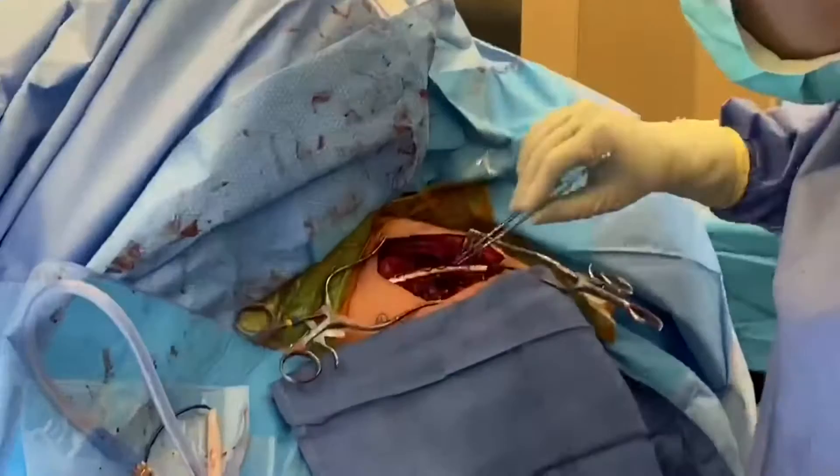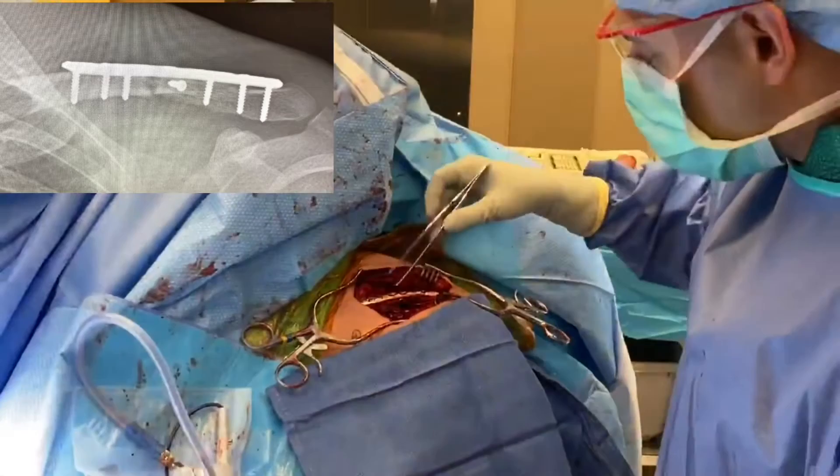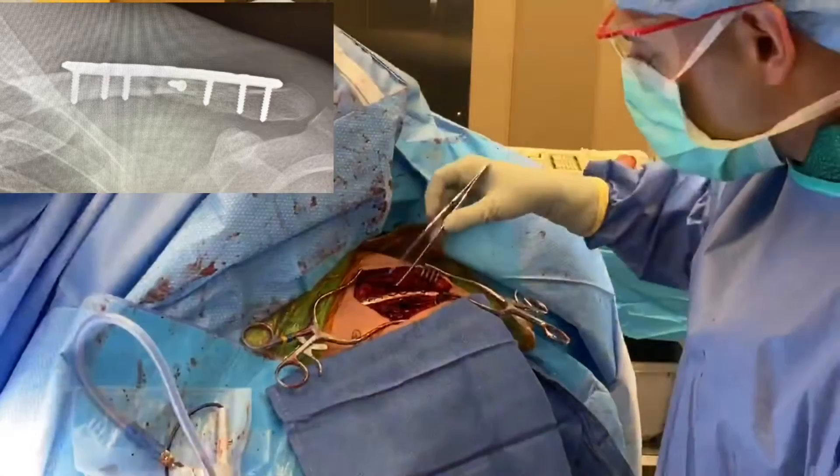Okay guys, so we have fixed everything here. We had that lag screw — you can see that going from front to back here. That stabilized the lateral fragment and then we were able to get that piece next to the other piece. We've got a stainless steel plate on top, three screws on the medial side and three screws on the lateral side. Everything is nice and stable now and hopefully this clavicle is able to hold up and heal.